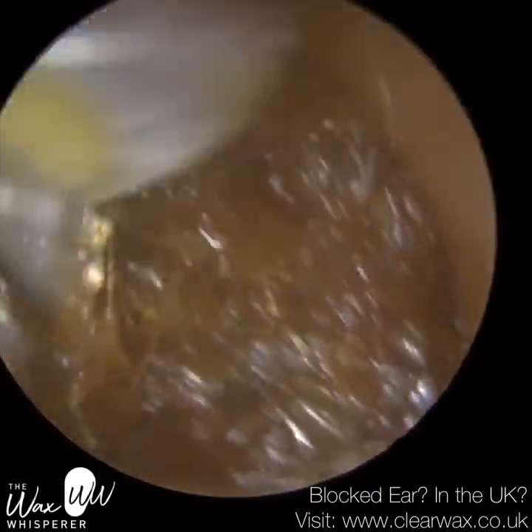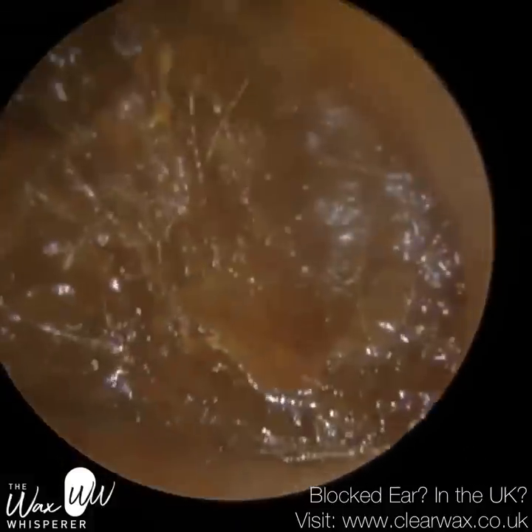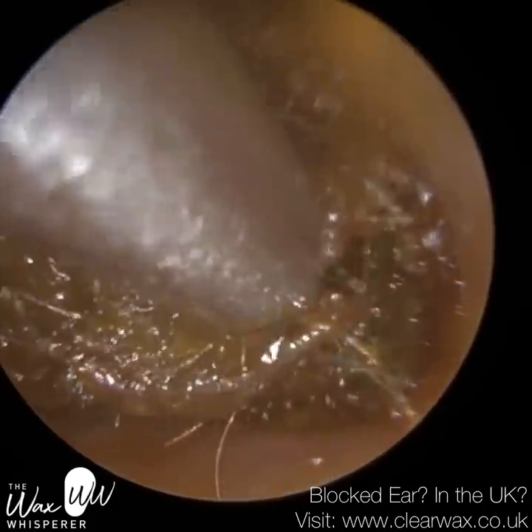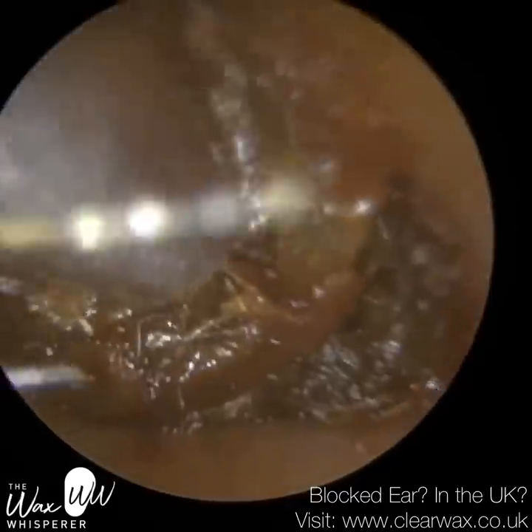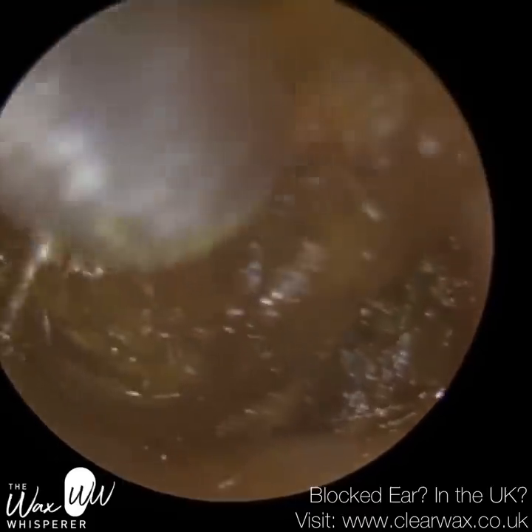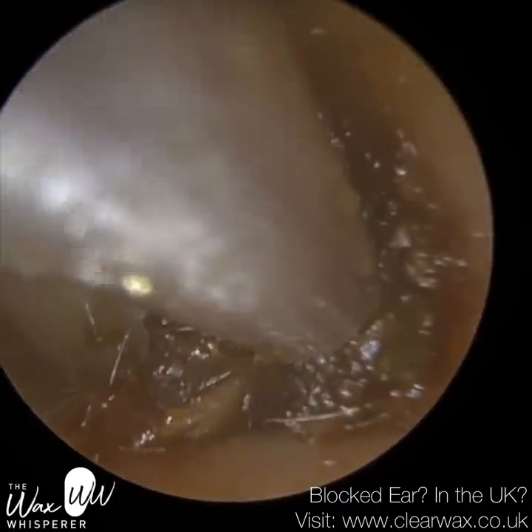Whenever you introduce oil into the ear, it can sometimes obscure your view. The outer third of the ear canal — you can see in this patient they've got a few hair strands there — and those hair strands can be coated by the oil, so when you put the endoscope in, it can smear against the lens. Also when you perform the suction itself, the oil can blur the lens of the camera. But with experience it's fine. I used to put the drops in and then drain the drops, wipe the inside of the ear, and then go back in. But more and more now I'm actually performing the procedure whilst the oil's in situ — I just find it gives better results.